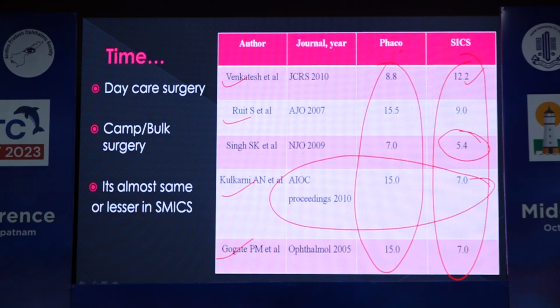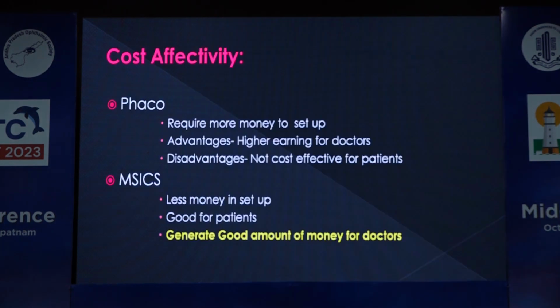Even you can do SICS in 2 minutes and Phaco in 2 minutes. It just depends upon your hand stability and your practice. So in time, I am not giving any weightage to either SICS or Phaco, that it is fast or slow.